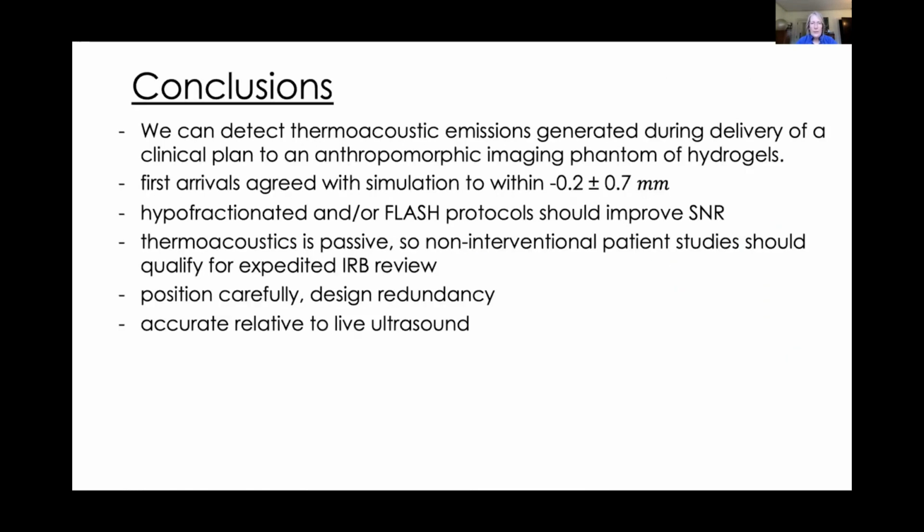Okay, so in conclusion, we can detect thermoacoustic emissions generated during delivery of a clinical plan to an anthropomorphic imaging phantom. And I will say that the Gruneisens in the phantom are a little bit different than what we expect in soft human tissue, but not much. So I'm confident that we can do well in patients as well. In this phantom that wasn't moving, that's probably the biggest difference, we got very good results within a pixel of the planning CT.